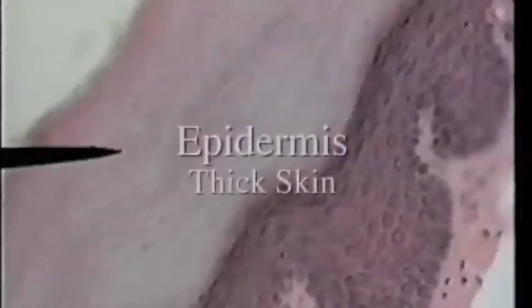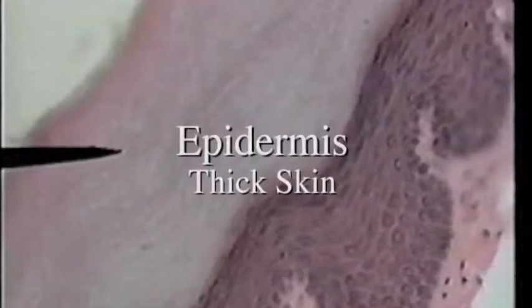We are looking at the epidermis on high power. The epidermis is composed of 5 layers. We are now going to begin looking at those specific 5 layers. The tip of the pointer is in the layer of dead cells that we call the stratum corneum. A thick layer in thick skin of dead cells, stratum corneum.